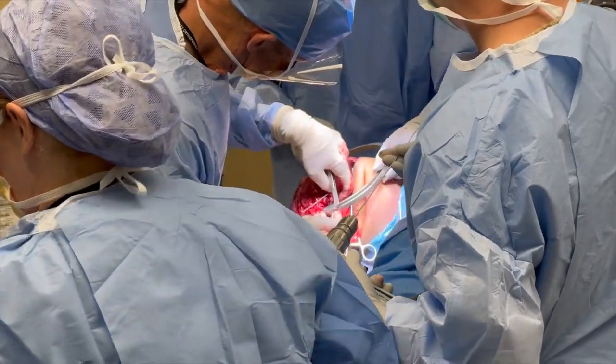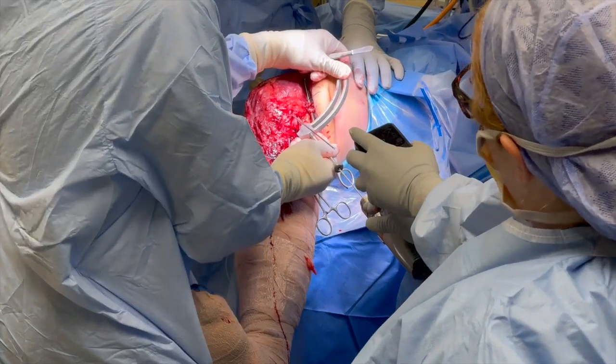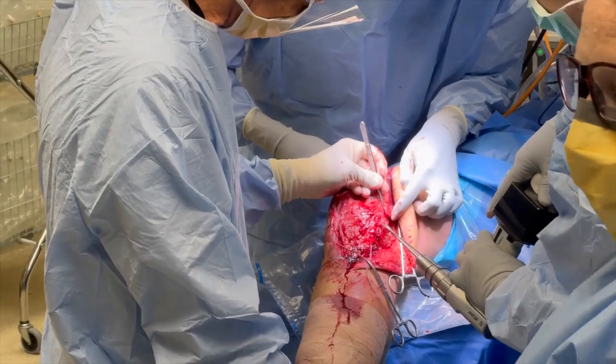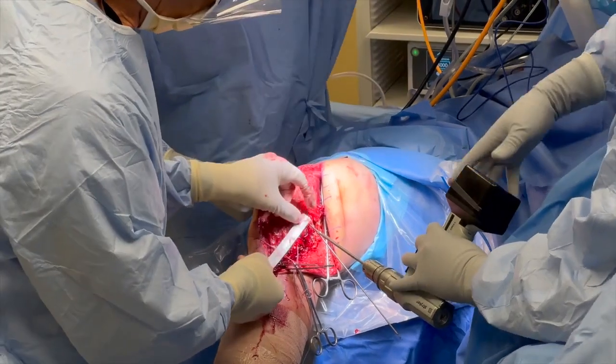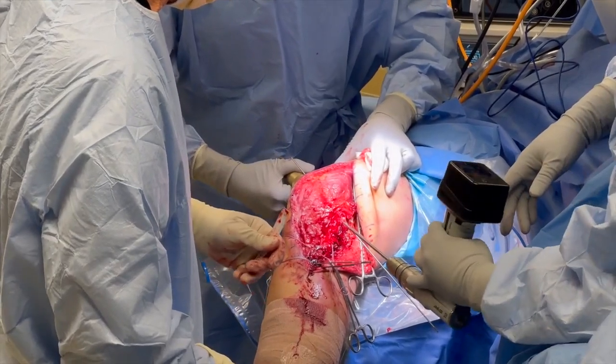Next, the femoral attachment of the POL is identified. A smaller arthrotomy is created to separate and lift the posterior medial capsule at the attachment site of the POL on the femur, located about 7.7 mm distal and 6.4 mm posterior to the adductor tubercle. A guide pin is drilled through the POL femoral attachment, parallel to the MCL guide pin. At least 9 mm between the pins is required to maintain a 2 mm bone bridge between the tunnels.